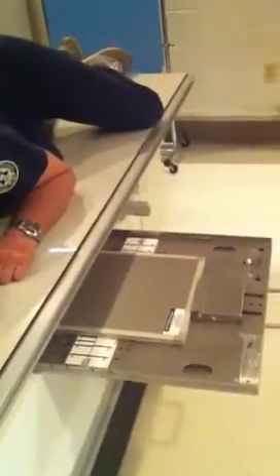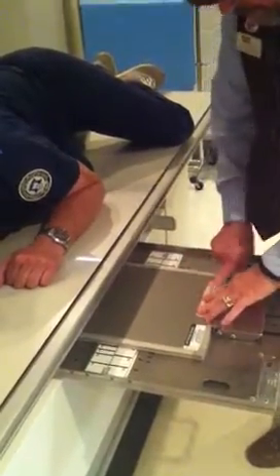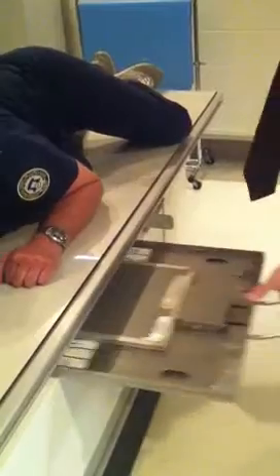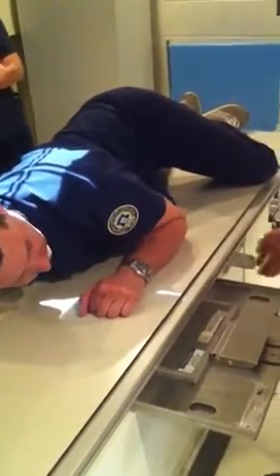Image receptors transverse. Right lateral, so we're going to use a right marker. Placed again toward the face, so that if it's in the structure, it's not in anything we care about. It's in the face. We're doing a skull. We don't care about face.